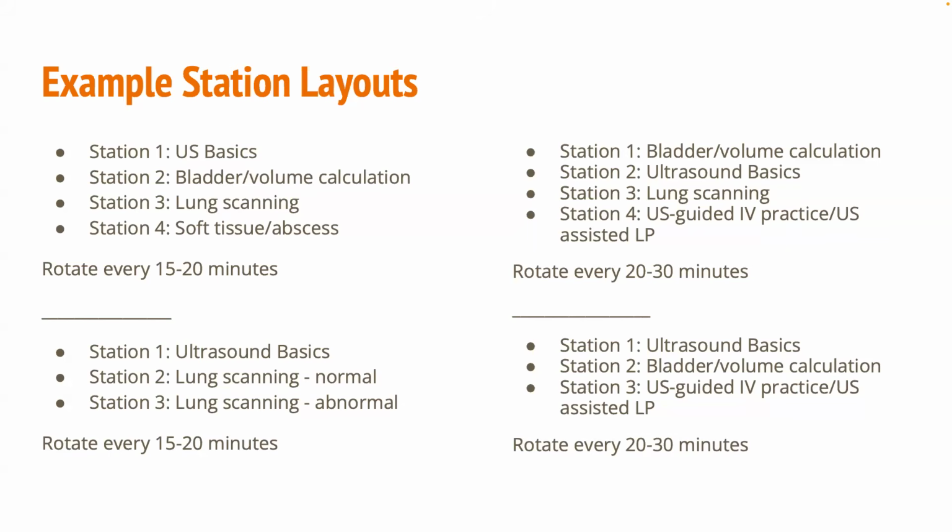And so the biggest issue that I see for learners, that you guys also probably see, is that their understanding of the orientation of the image in space to where their probe is very difficult. And so that's a difficult concept for them to grasp quickly in just the setting of an image because they're trying to remember the anatomy, think of the anatomic plane, and then put that anatomic plane within what they're seeing on the ultrasound and the orientation of it, right?